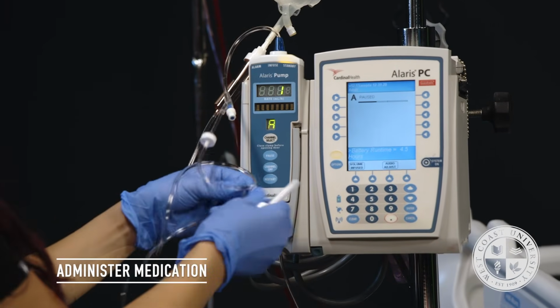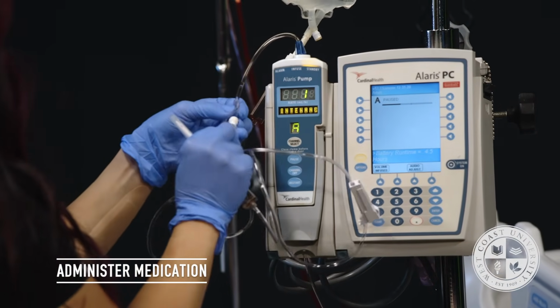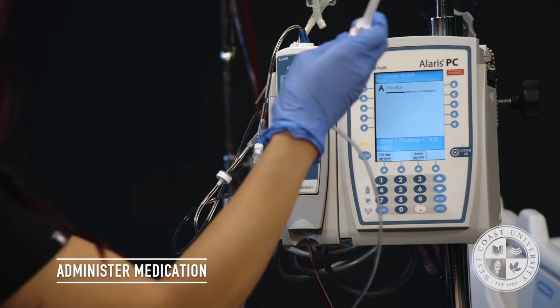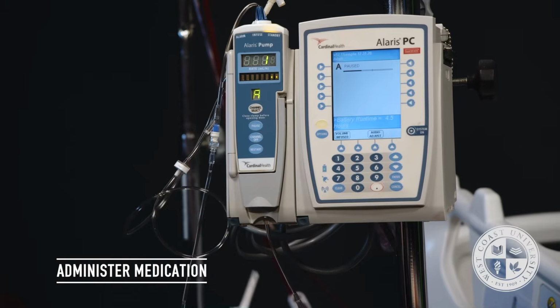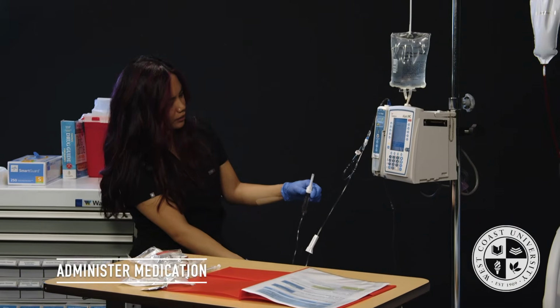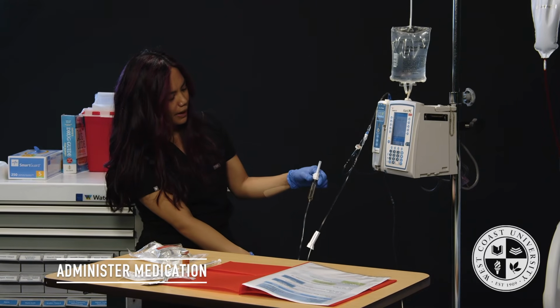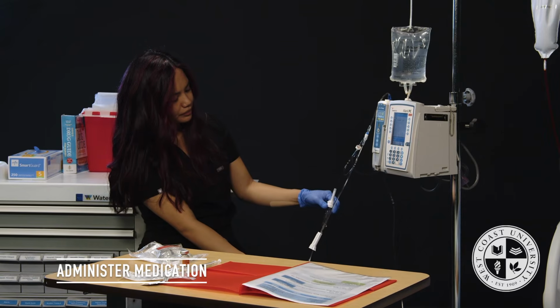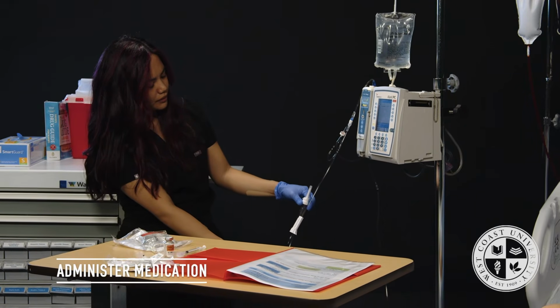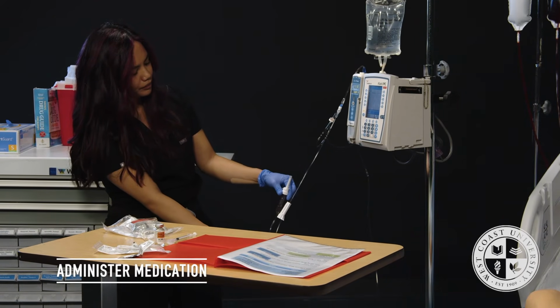And we untangle my lines. Okay, I'm going to go ahead and connect my secondary tubing into that port. I'm going to ensure that my clamp is open. I'm going to lower my secondary tubing chamber below my primary line to back prime the tubing. Allow it to back prime at least halfway and get all the air bubbles out.